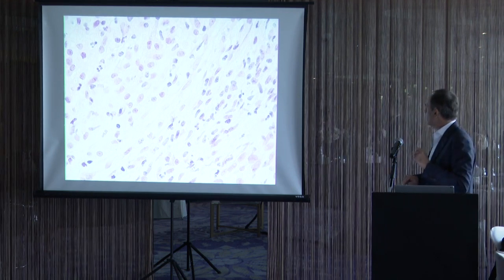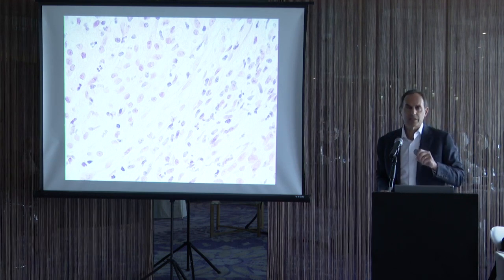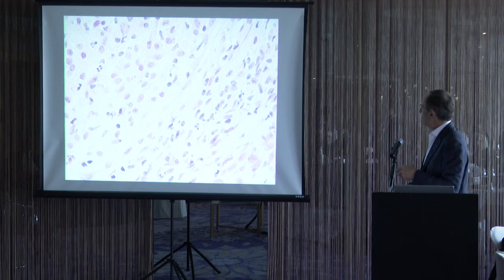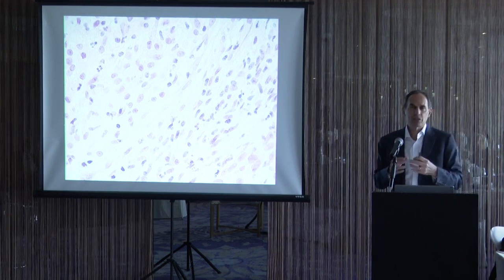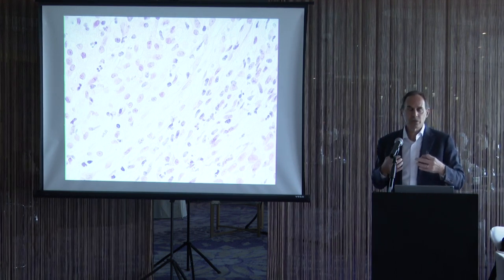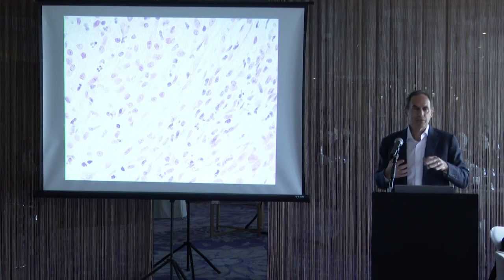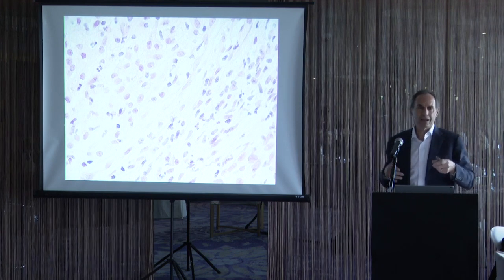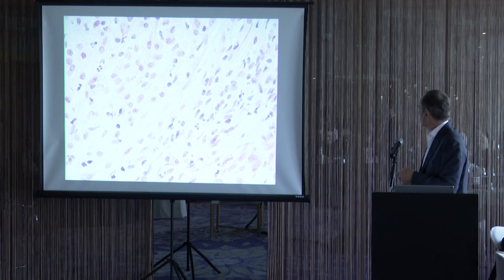So what is the clue to prevent you from diagnosing this as a high-grade prostate cancer? The clue is the presence of admixed inflammatory cells. As I mentioned before, prostate cancer and inflammation typically are not seen together. So if you see something that you think is high-grade cancer, but there's admixed inflammation, you should always ask yourself, could this be nonspecific granulomatous prostatitis? Because prostate cancer should not have these neutrophils scattered throughout.